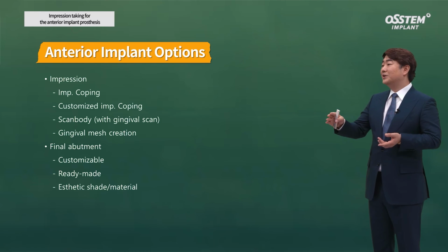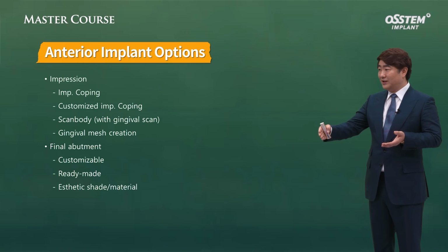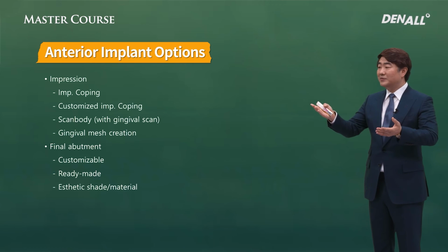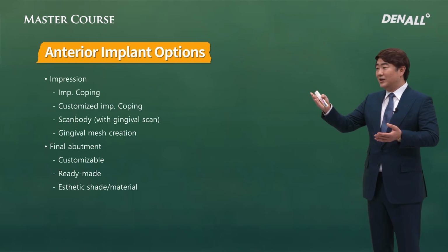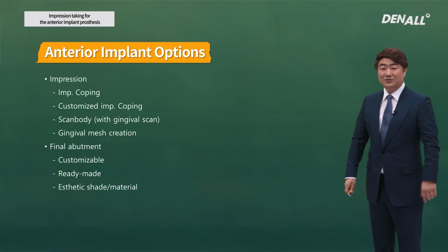With scan body scanning, compared to that, you reference the screw abutment external shape. In using an impression coping, the model needs to be scanned again and digitalized. Then again, the temporary external shape can also be taken into reference. Hence, whatever you scan or when you mold, the screwed abutment external shape can always be taken into consideration.